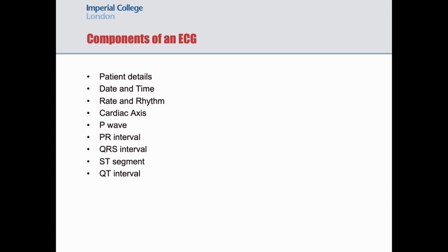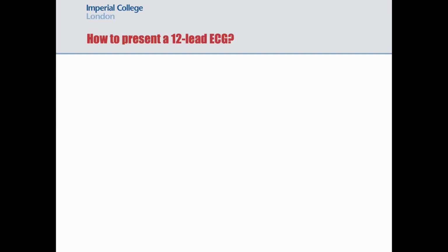In the rest of the tutorial, we're going to go through everything from rate to rhythm to QT interval. An important thing is during your OSCE, you need to be able not just to understand a 12-lead ECG, you have to be able to present it as well.